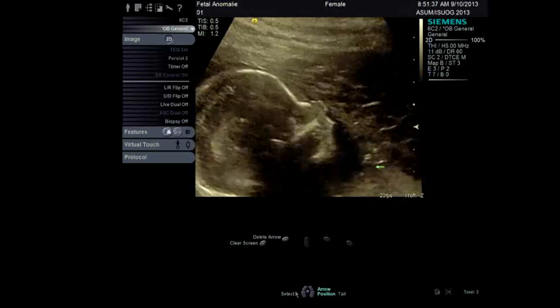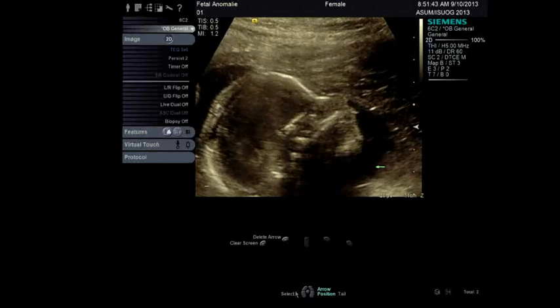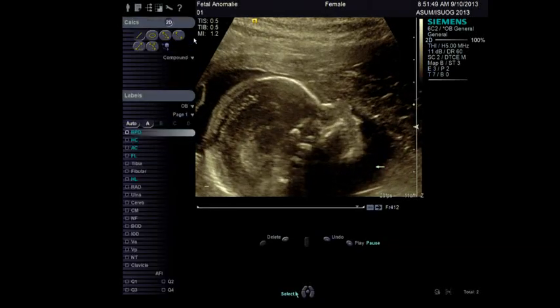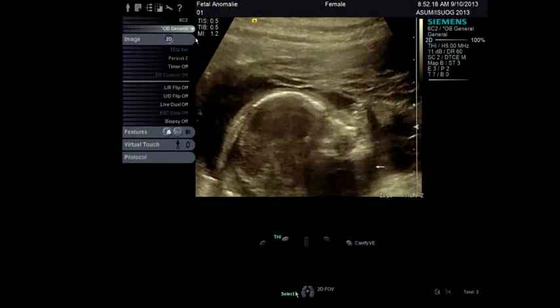And you can take all sorts of measurements from the face and from the bones in the face, starting with, of course, the hard markers such as the nasal bone, but also some of the other features, for example, looking at the ratio here between the skin overlying the nasal bone and the next line here, which has been recently shown. I don't know if some of you saw it in the White Journal as quite a strong marker for aneuploidy also.